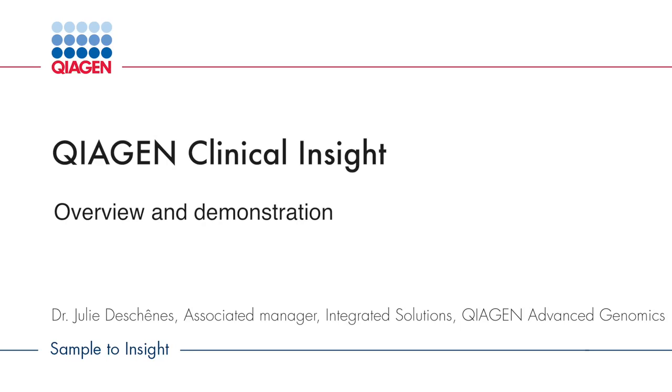Today we will take a look at QIAGEN Clinical Insight. Our QCI platform allows you to answer three basic but important questions for anyone interpreting NGS variants in a clinical setting. Is the observed variant real? Is it clinically relevant? Or is it actionable? And this is what I will try to achieve today during this demonstration.